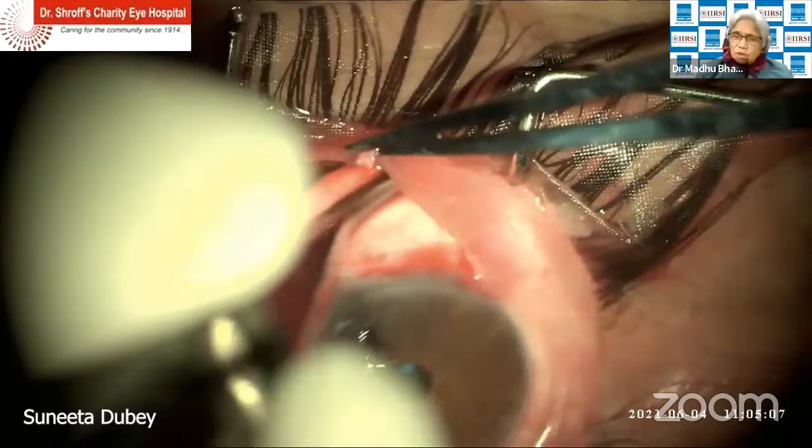Also, sometimes the sponges are brittle. So one must ensure a very good quality sponge, which is not brittle, because with the brittle ones, a small piece breaks off inside, and if it stays behind, it will lead to necrosis of the conjunctiva and bleb leak. So there are polyvinyl sponges and methylcellulose sponges, which should be used. You're absolutely right, and a broader application.